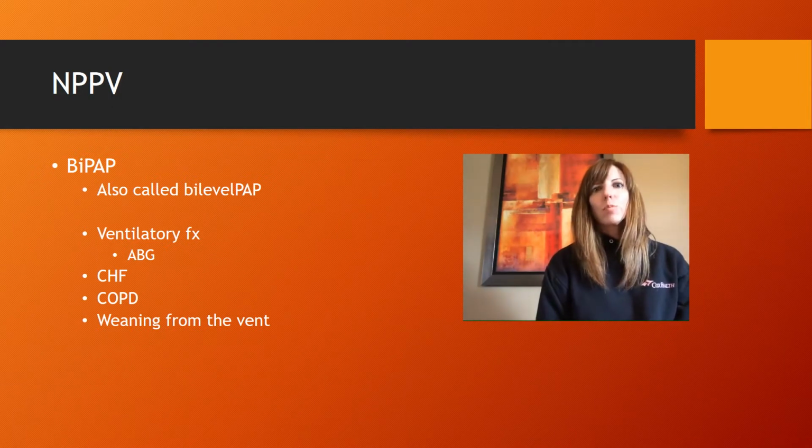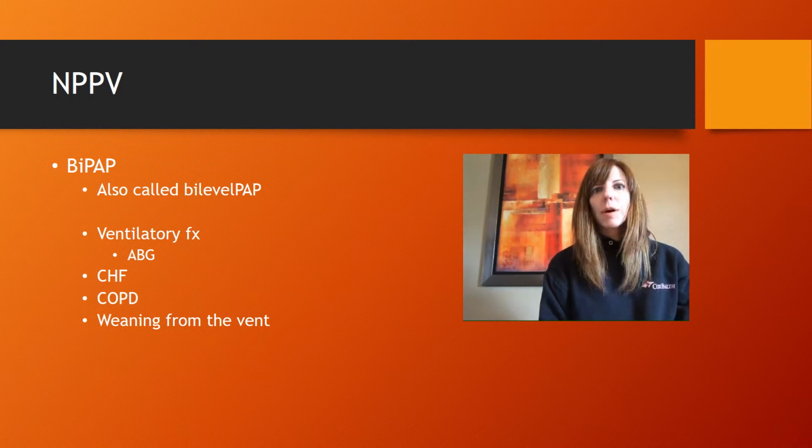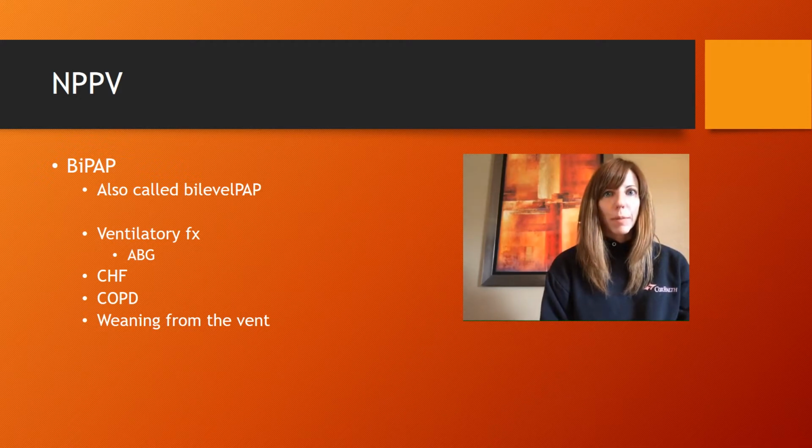All right, guys, welcome to part 2 of non-invasive positive pressure ventilation. In part 1, we talked about CPAP, which is continuous positive airway pressure. We talked about how that is used for COPD patients, people with obstructive sleep apnea, people who have exacerbations of the COPD, CHF, pulmonary edema, refractory hypoxemia, which is shunting. All those things are for CPAP.